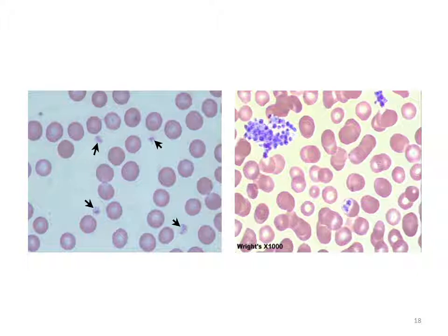The platelets are the small purple dots to which the black arrows are pointing on the left slide. Clumps of platelets are seen on the right slide. Do a platelet estimate and ensure it is within 25% of the actual platelet count.